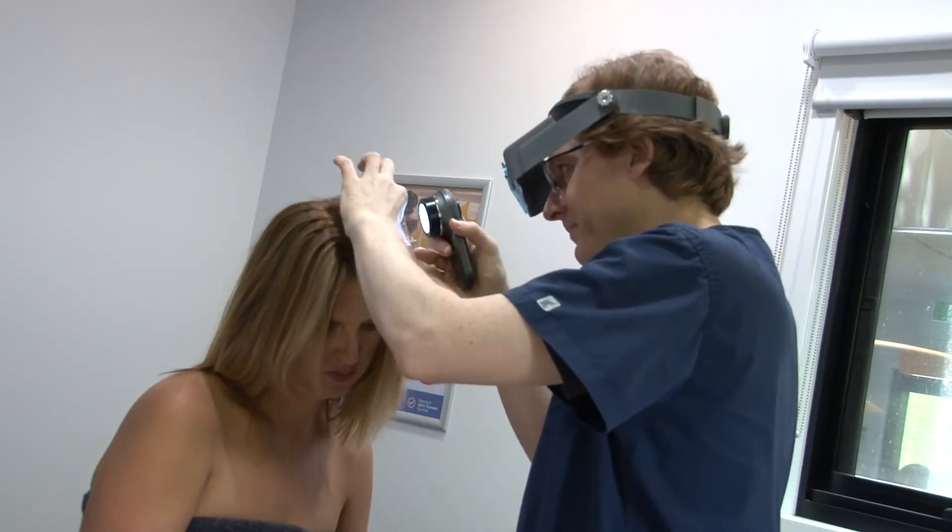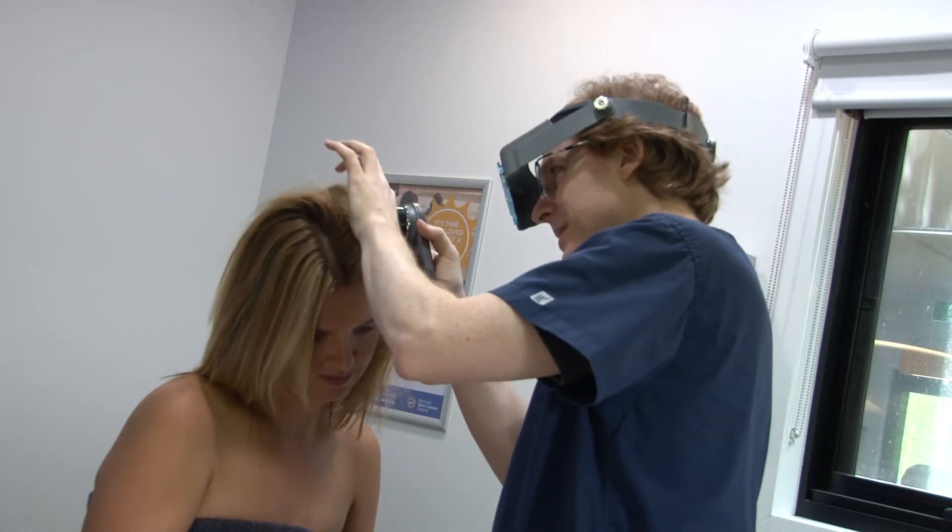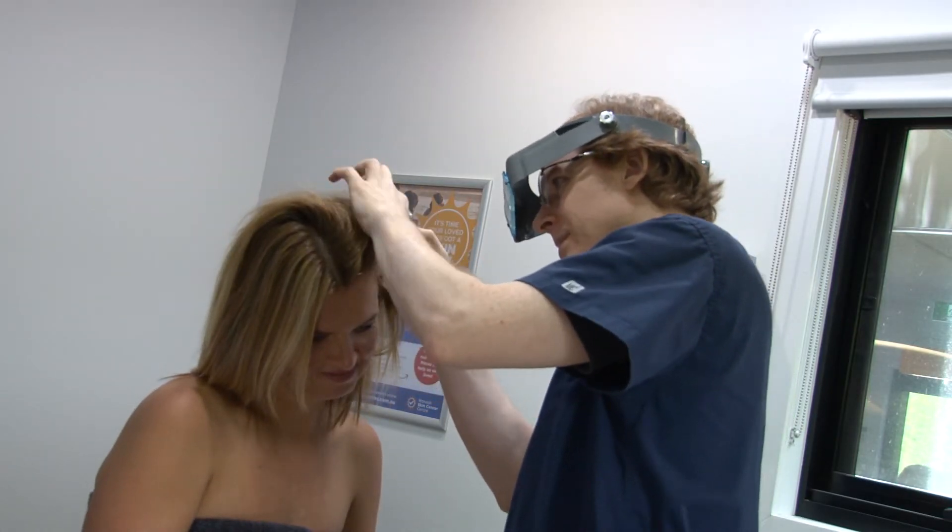Because five of my patients have had scalp melanomas underneath their hair, and maybe one in every five to ten thousand scalps that I check has a melanoma that the patient doesn't know about, I feel that I should look through scalps. Probably means I will find less total melanomas in my career, because I'll just be wasting two minutes a patient on most patients. But if what's important isn't how many you find, but how many you miss, then hopefully I will miss less. So I try to find a part line, I rifle through the right half of the part, then the left half, just looking at white scalp most of the time, flicking the hair out of the way.